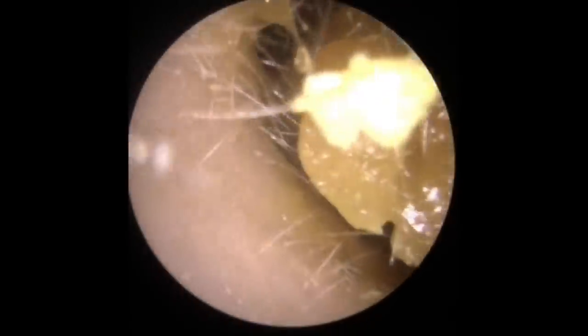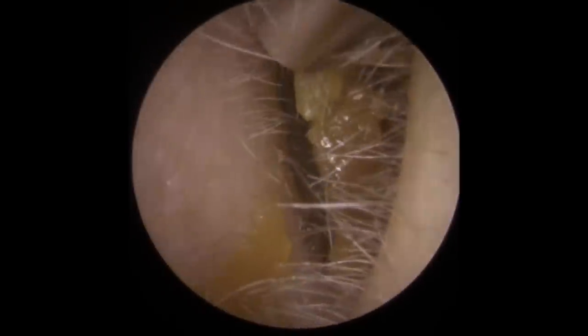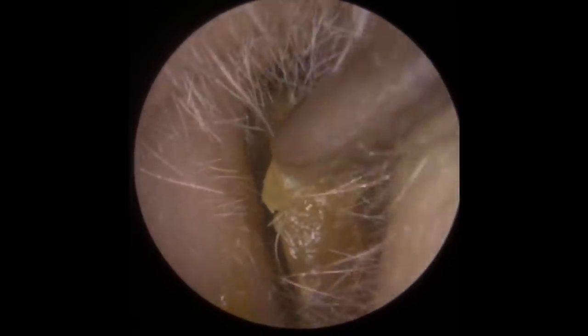Hi everybody, this is Rhys Balber from Audiology Associates. Thank you very much for watching our earwax removal compilation video today. We've got two patients in this video. So this is the first patient - they've come through, this gentleman's got a little bit of mild discomfort and reduced hearing in both ears.